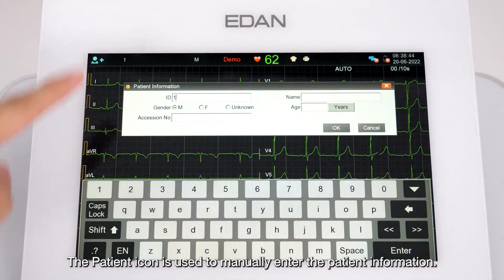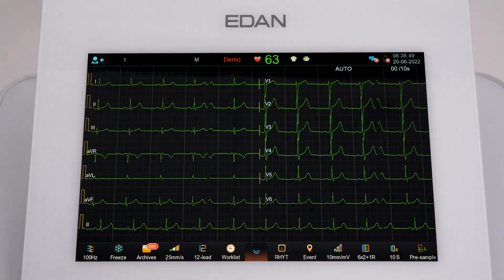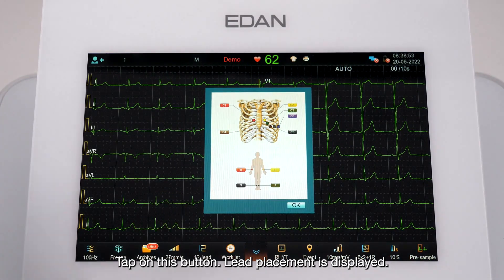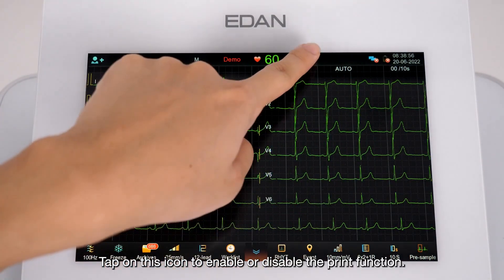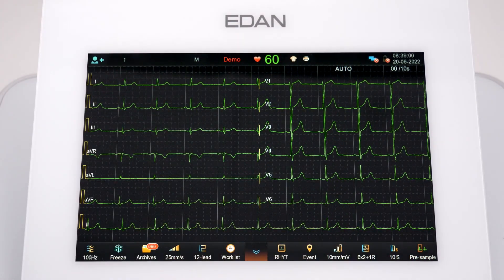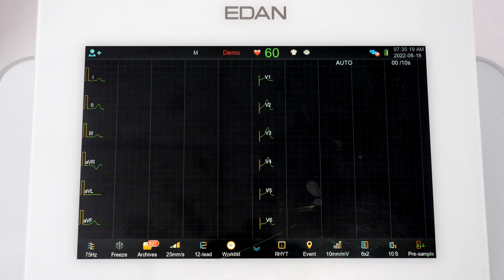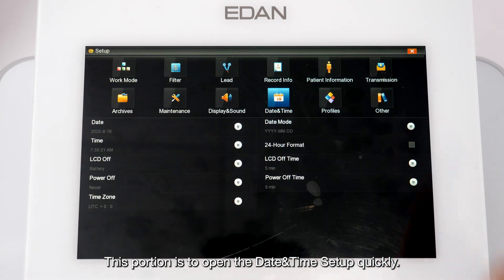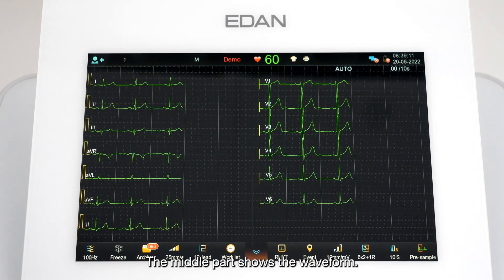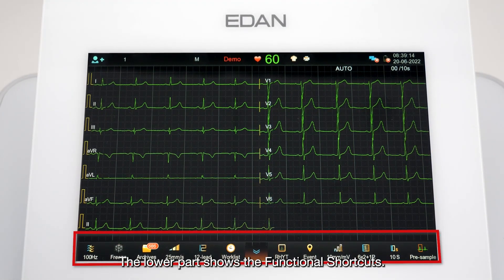The patient icon is used to manually enter patient information. Tap on this button to display lead placement. Tap the print icon to enable or disable the print function. This icon opens transmission setup quickly, and this portion opens the date and time setup quickly. The middle part of the screen shows the waveform, and the lower part shows functional shortcuts.